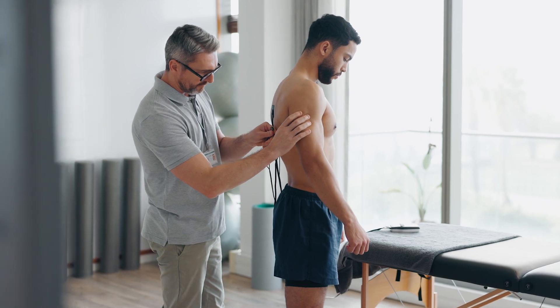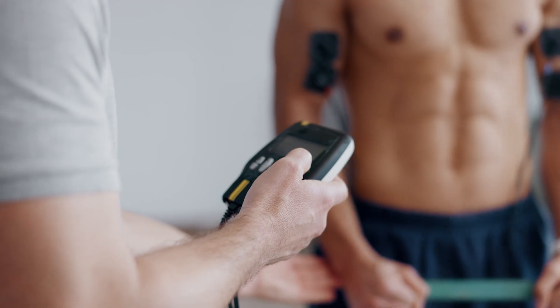Transcutaneous electric nerve stimulation — these are little devices you can use at home, or they might be used in an office with an athletic trainer, a physical therapist, a chiropractor, or even an acupuncturist. They're using electrodes placed on the skin, or in an acupuncture setting placed on the needle, sending electrical currents into our bodies and into our nerves to help essentially decrease pain. That's what we're trying to do with TENS units.